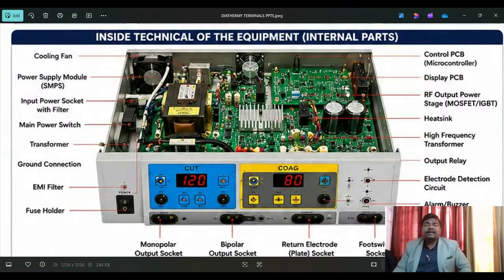For example, resistors, capacitors, and multiple inductors, so many components are placed, and diodes are there. You have to check all things: diodes, capacitors, transistors, RF filters and MOSFETs, batteries and switches, every component and connector, everything.